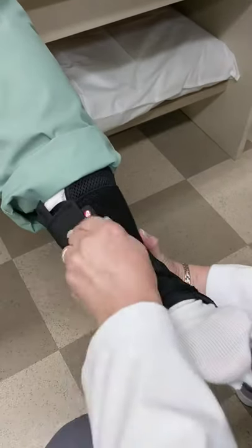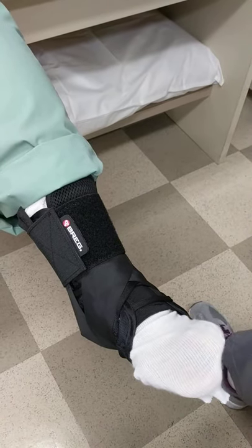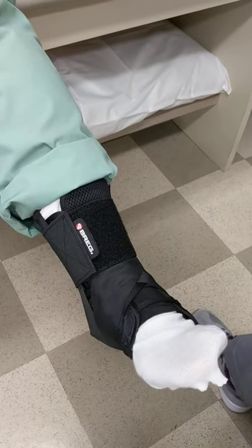Grab the elastic band, go all the way around. This allows you to move your foot up and down, but does not allow you to roll your ankle.